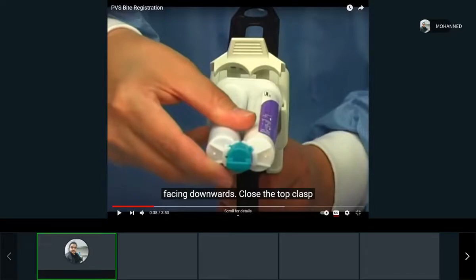And you can see right there how much easier it is compared to alginate. Alginate, you have to have the canister and the powder, and you have to fluff it, you have to put the measures, and you have to put the water, and you have to mix and all of that, right? This, you just put it in the gun and you're good to go, right? It gives you measures, it gives you the right mix. It is much better than alginate. The only problem is it's just more expensive. And that's why we're still using alginate, because it's a little bit cheaper. Otherwise, this is much easier.